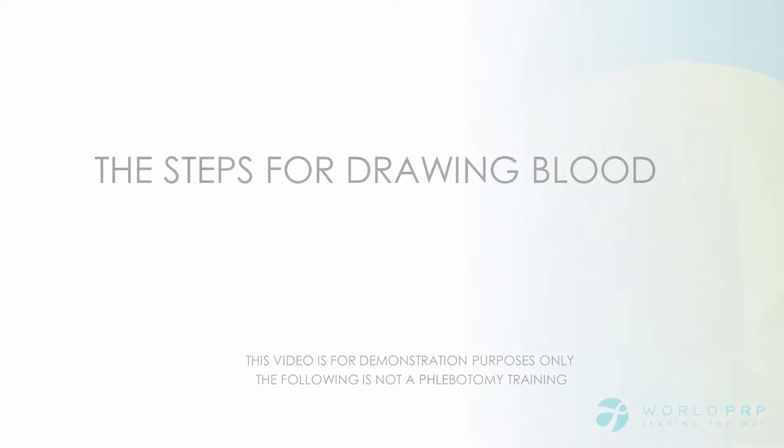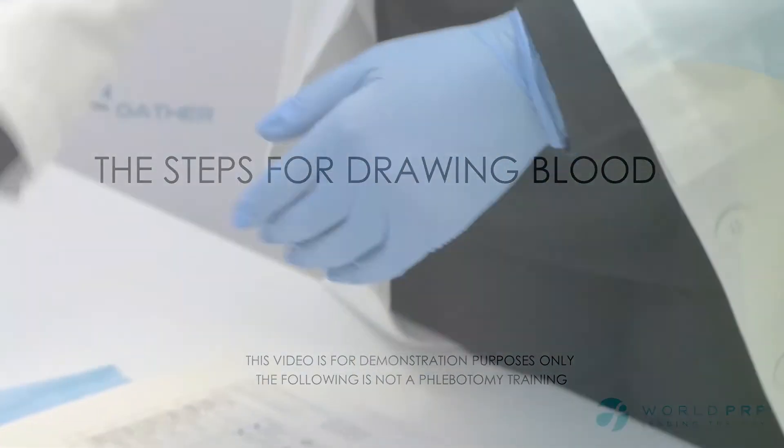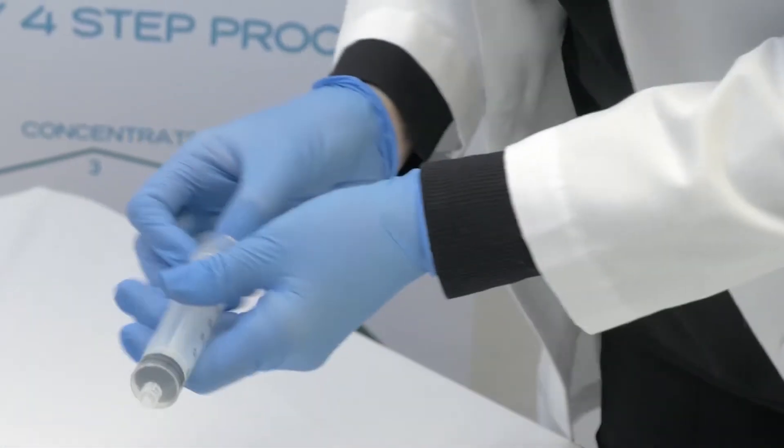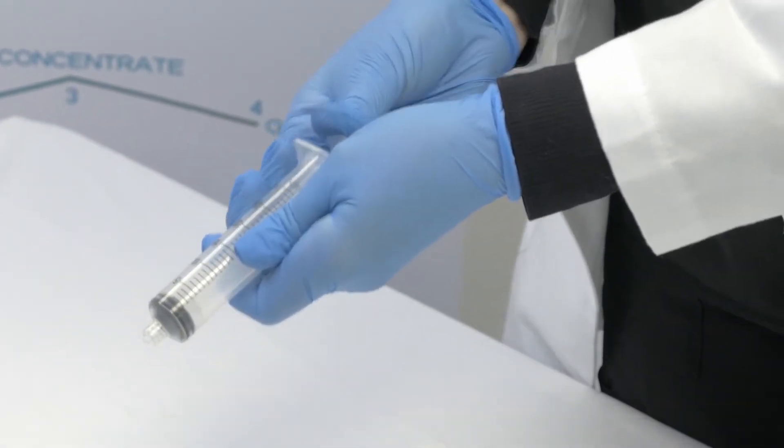We will now demonstrate how to use the medical supplies to perform a blood draw. This is for demonstration purposes only. This is not a phlebotomy training. Put gloves on and prime the 30 ml syringe by pulling the plunger back and forth a few times.